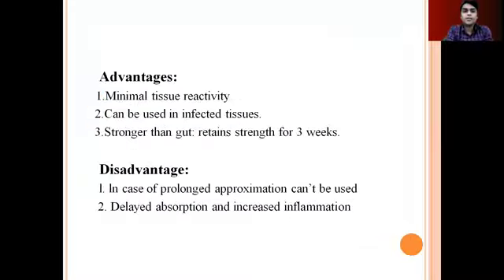The advantages are that there is minimum tissue reactivity. It can be used in infected tissues. It is stronger than gut and retains its strength for 3 weeks. The disadvantages include that in case of prolonged approximation, it can't be used. There is delayed absorption and increased inflammation when we use Vicryl.